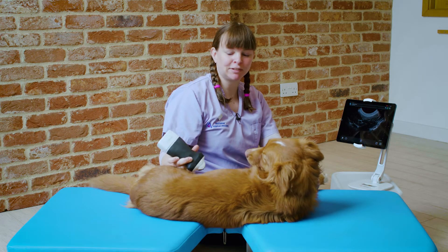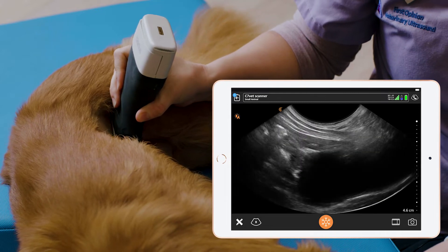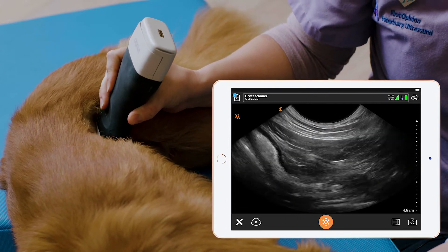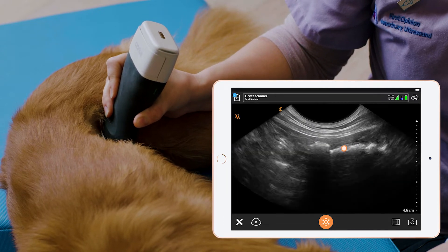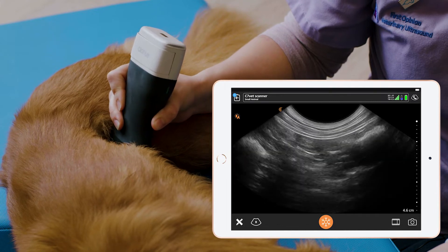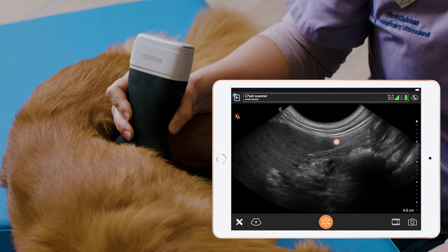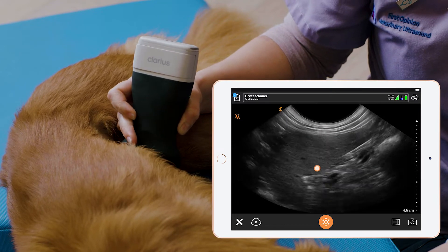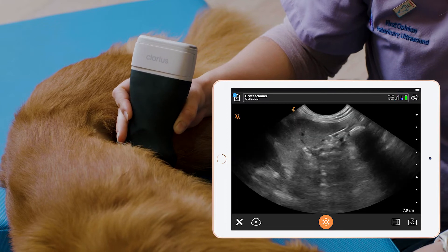We will start with the left limb of the pancreas. We need to start by looking for the descending colon. We find that above the bladder — we go dorsal to the bladder where we find this gas-filled structure which is the colon. We follow that in longitudinal cranially, and where that dips off we'll see the spleen coming into view, and that's where the colon goes into the transverse colon.